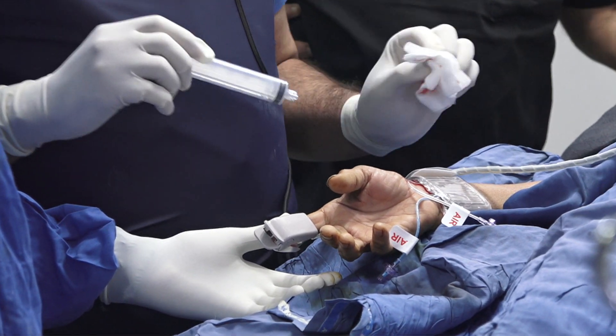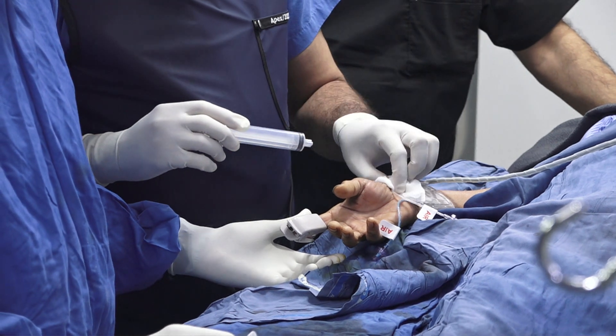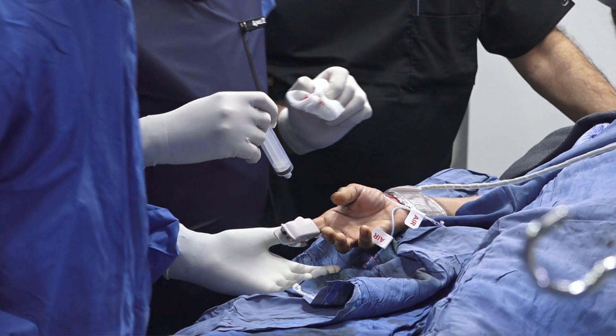These are the highest risk radials — they will close on you, and next time you come, they are gone. So tomorrow when we bring her back, we will try to show if the radial is open or not.